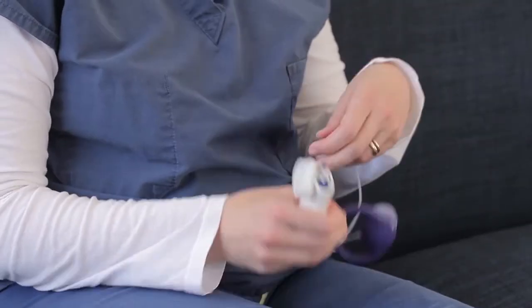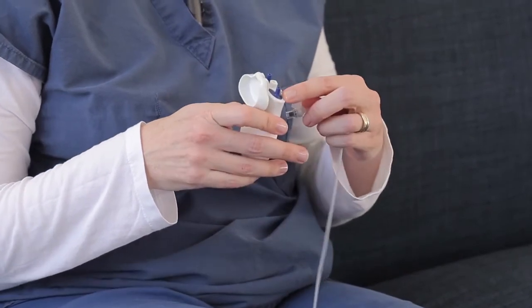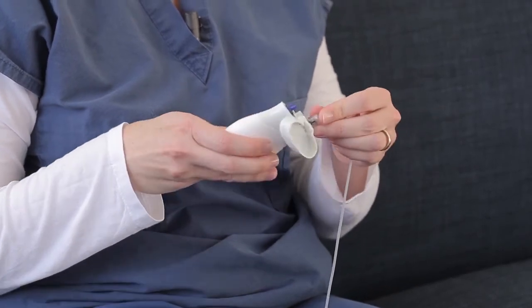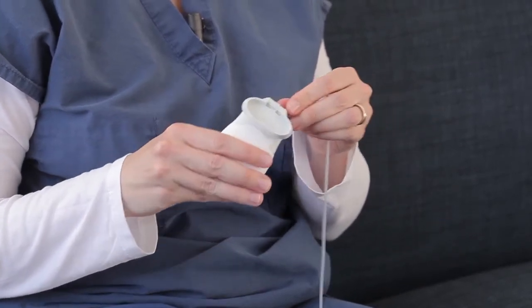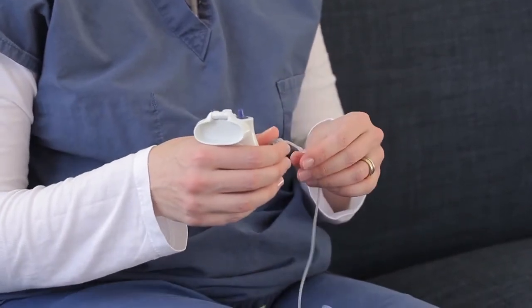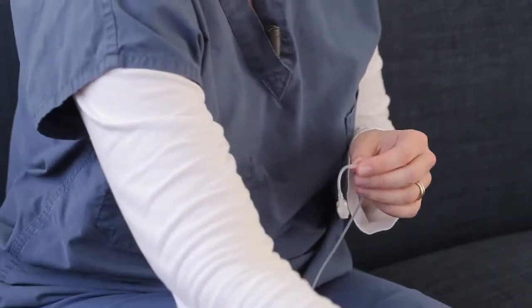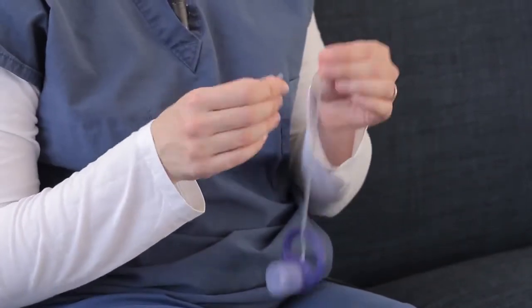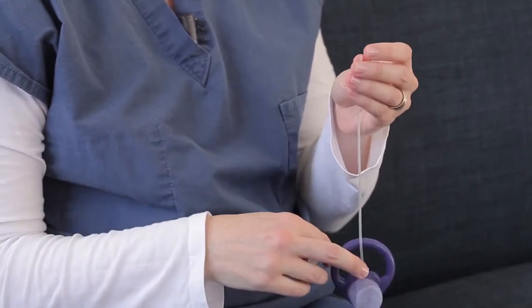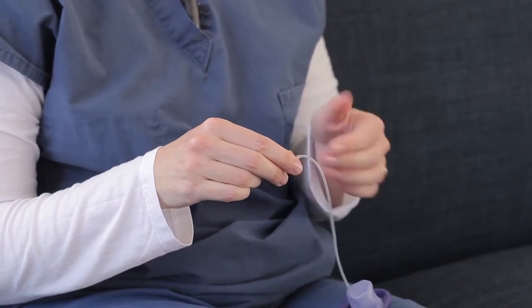If you're unable to deflate the insert, you want to make sure that it is attached to the minus port of the pump. You want to make sure that the black part of the valve is pushed all the way into the pump. If you're still having trouble deflating the insert, you can remove the valve from the insert. And as a last resort, if you're still having trouble deflating the insert, you can cut the tube above the valve.